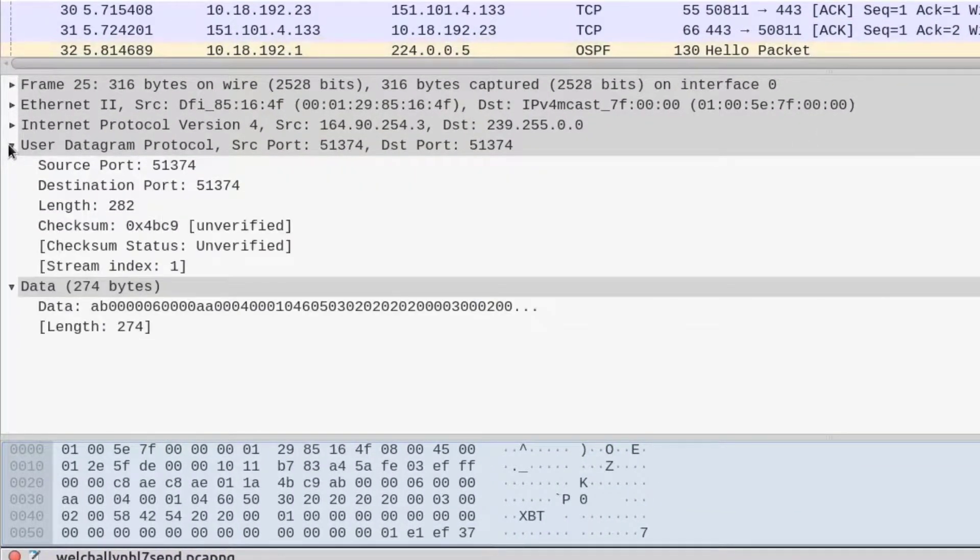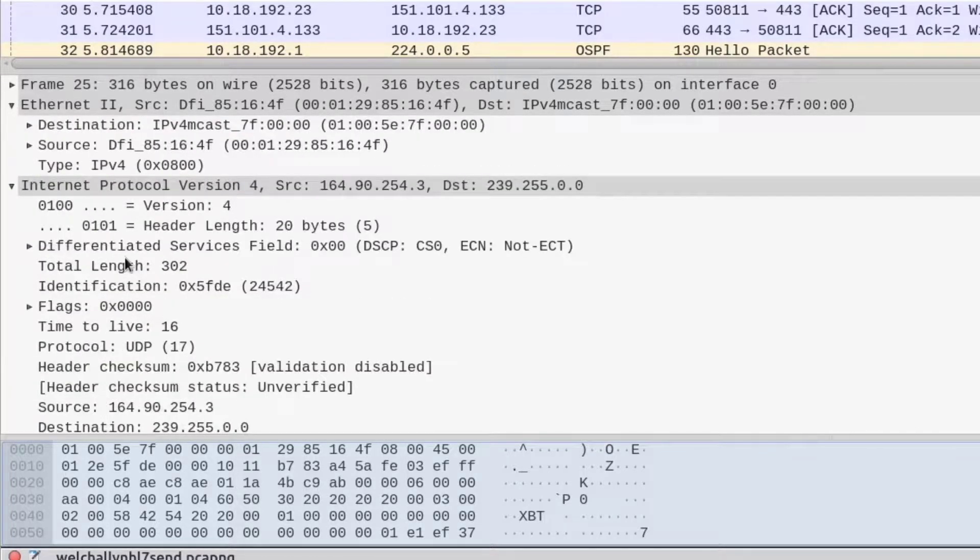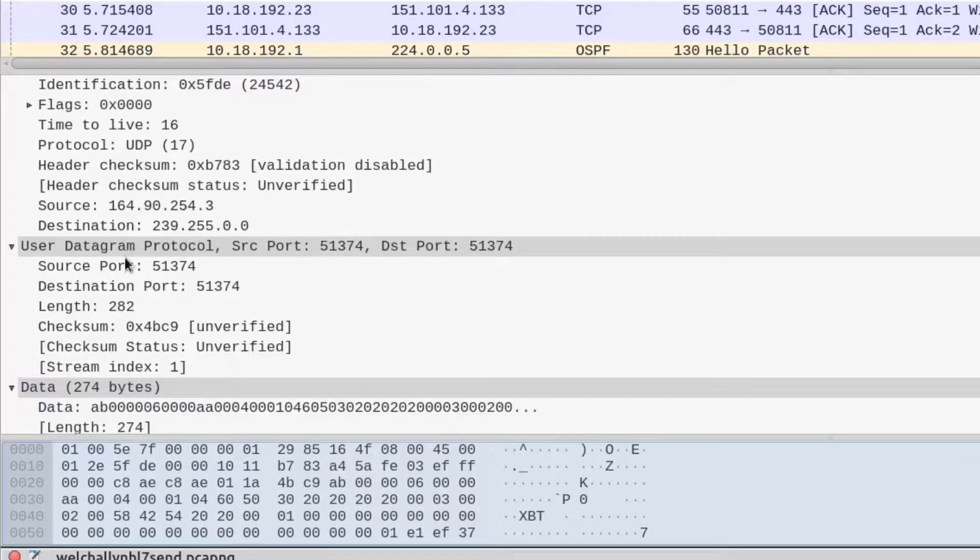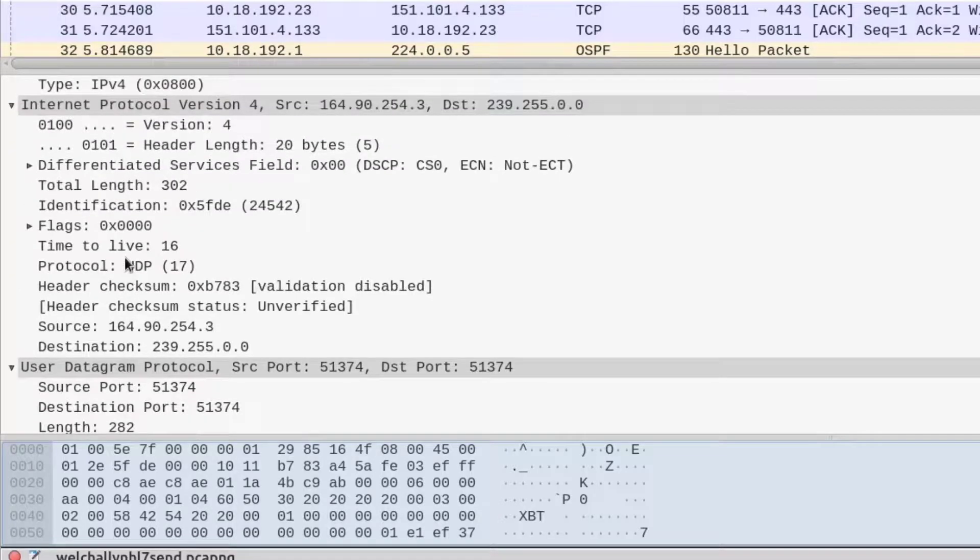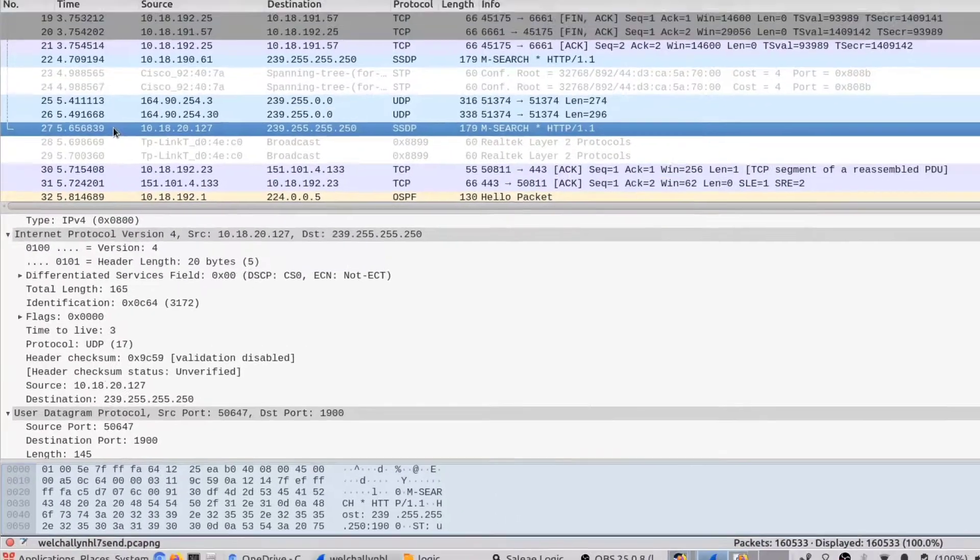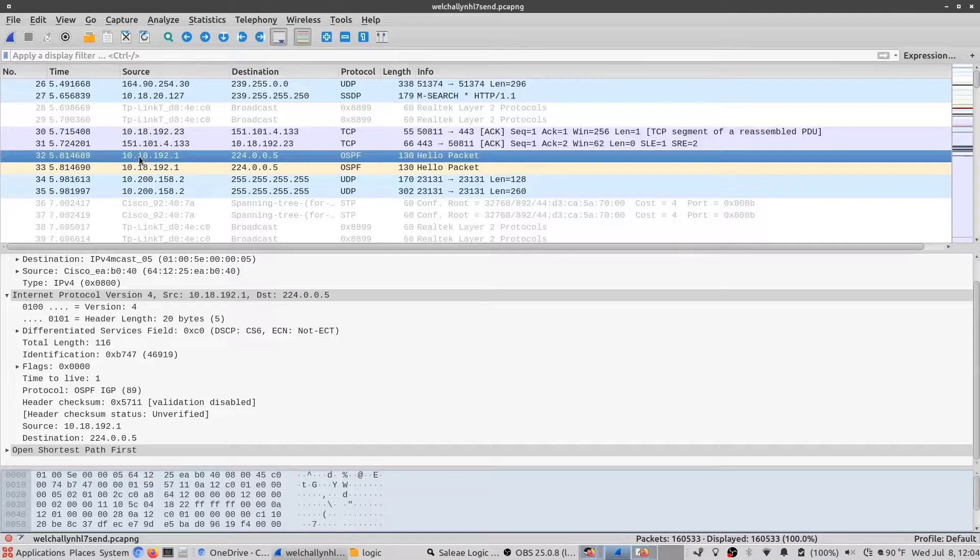One of the nice things about Wireshark is it's able to break down the packet information. You can see here these are all the individual data components of a given packet. As I change the packets here, you can see the information contained in those packets will also change.